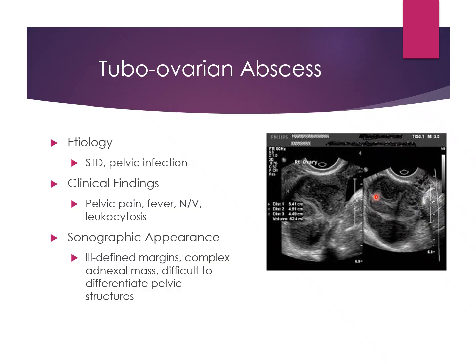And for ultrasound, when you are doing a pelvic ultrasound and you see that fallopian tube and then you see the ovary and you see this very complex fluid collection, try and see if you can add a little pressure. It's going to be uncomfortable for your patient, but if you're not seeing the ovary being separated from the fallopian tube, you're most likely dealing with a tubo-ovarian abscess, because they are now starting to fuse together and create almost like an adhesion there.